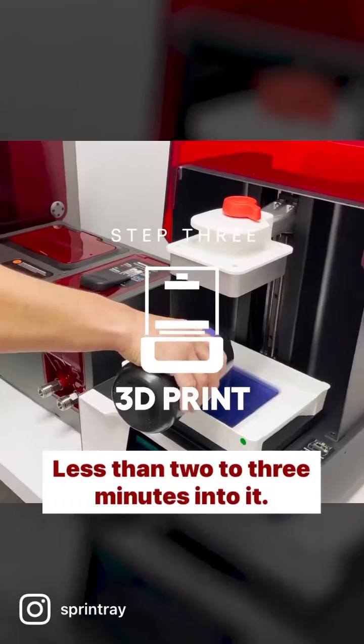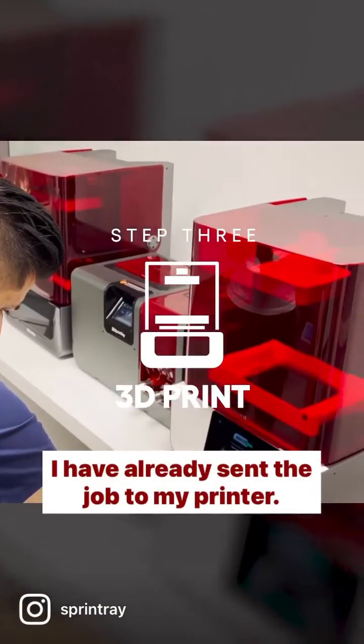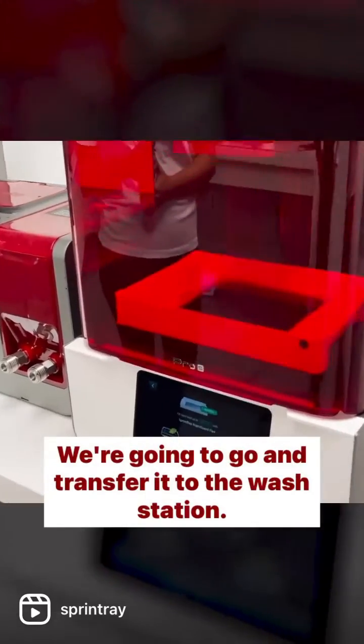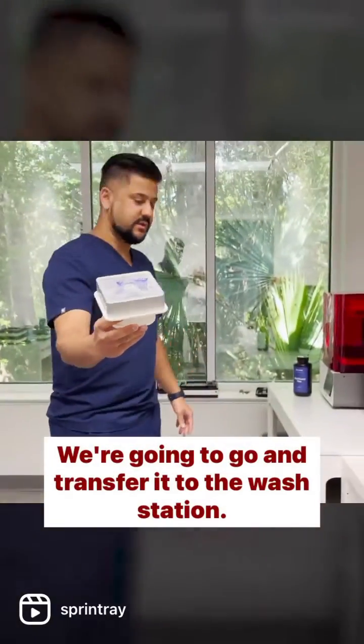Less than two to three minutes into it, I have already sent the job to my printer and we're going to transfer it to the wash station.